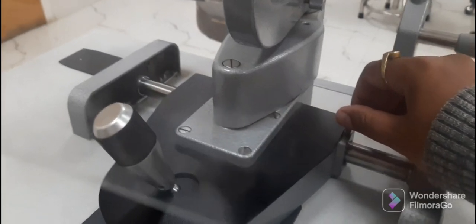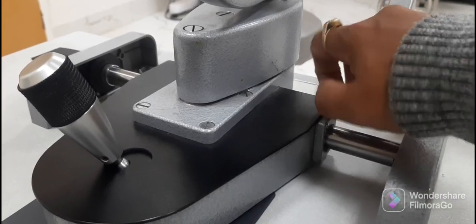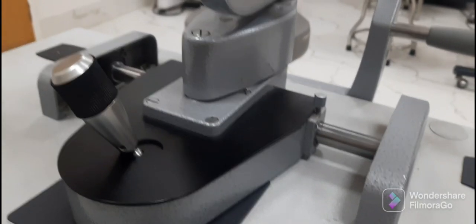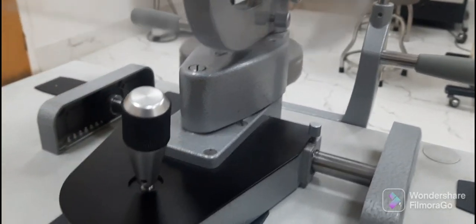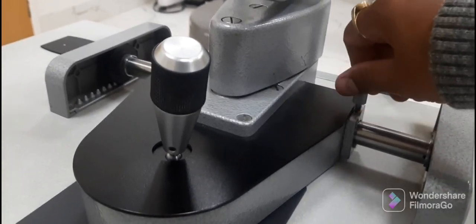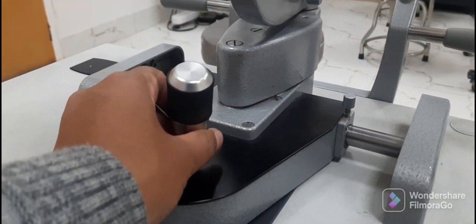Towards the right side of the slit lamp, there is a small screw called the locking screw. It is used to lock the slit lamp when it is not in use by rotating it in the clockwise direction. Once locked, the slit lamp cannot be moved even with the joystick, which is very useful during transportation. After unlocking the screw, the slit lamp is easily moved in the desired direction.